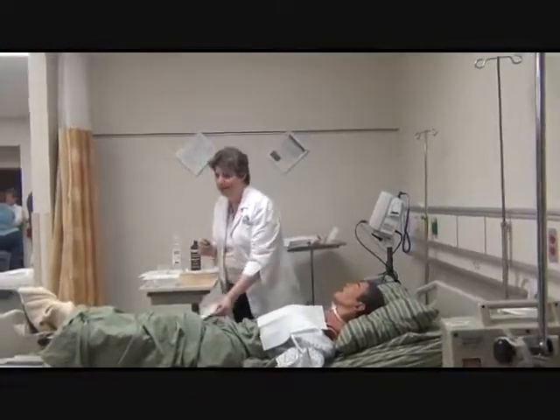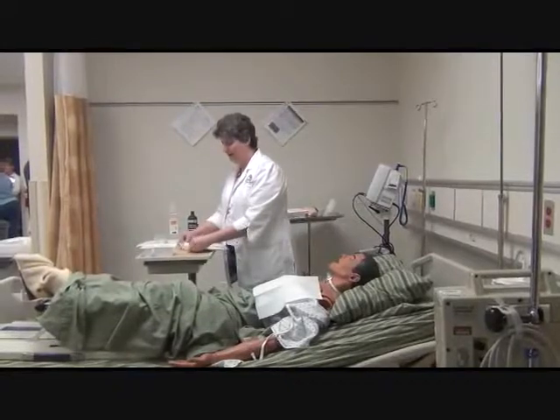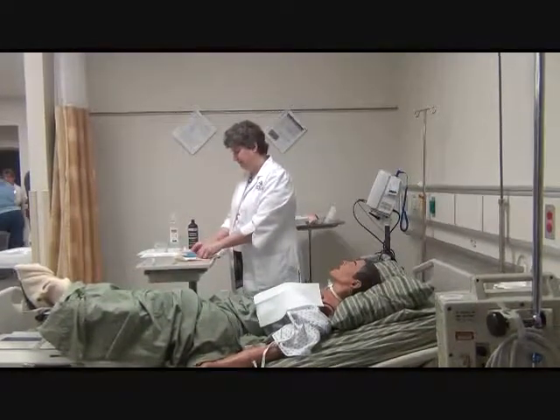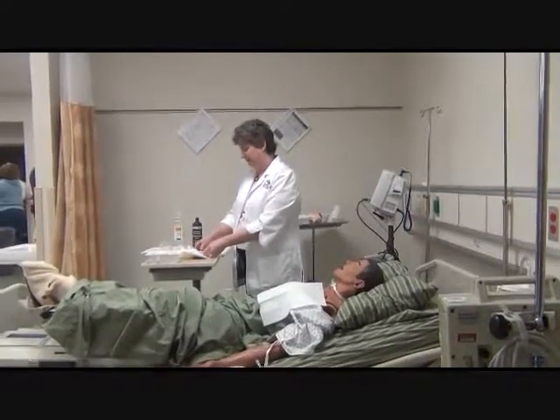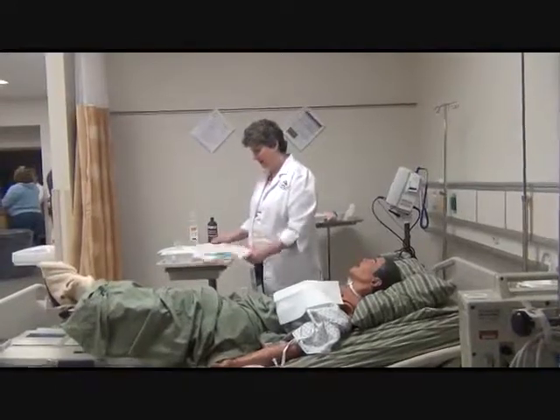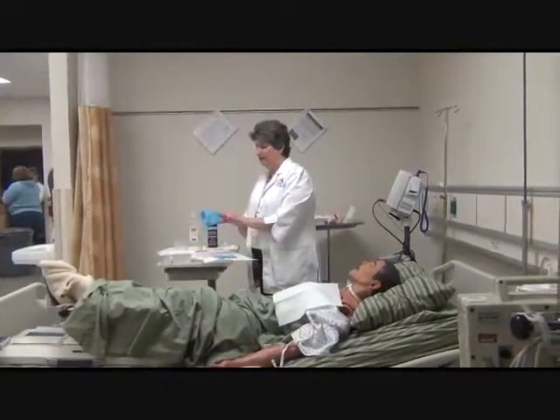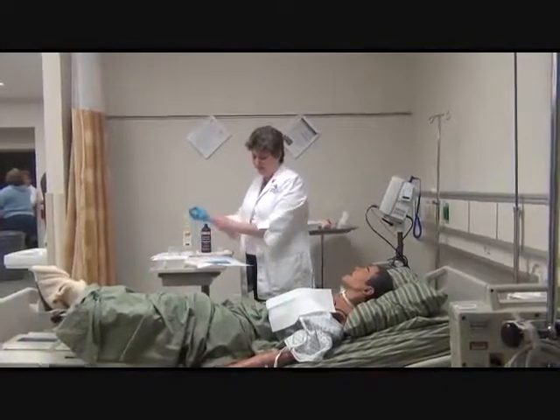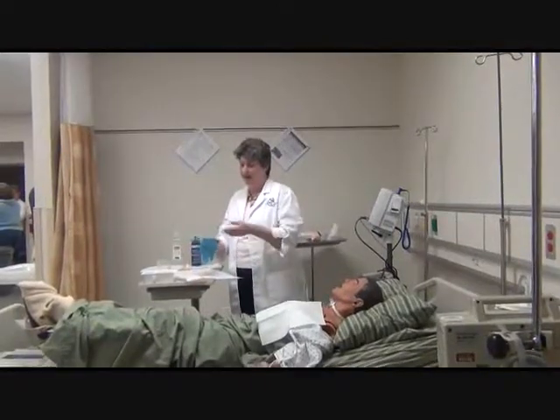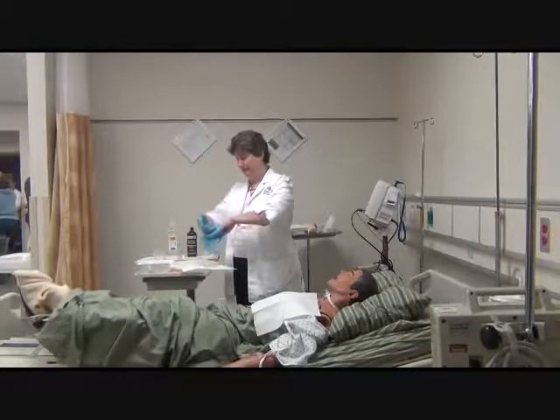At this point, we're going to need our sterile gloves again, and we're going to set up our solutions. Again, I decide which hand is going to be my sterile hand and which one is going to be my clean hand. I use my dominant hand as my sterile. Then I'm going to put this glove on. Again, it's just as easy. Get in the habit of doing it as a sterile procedure.